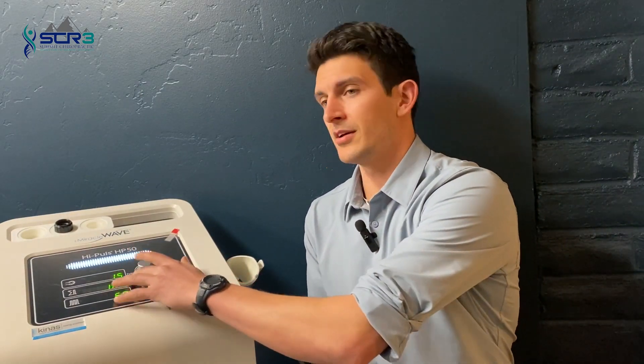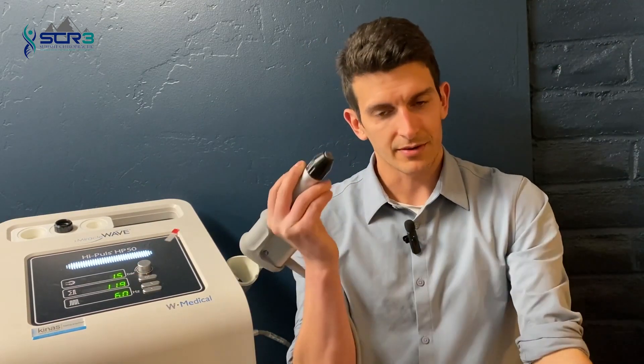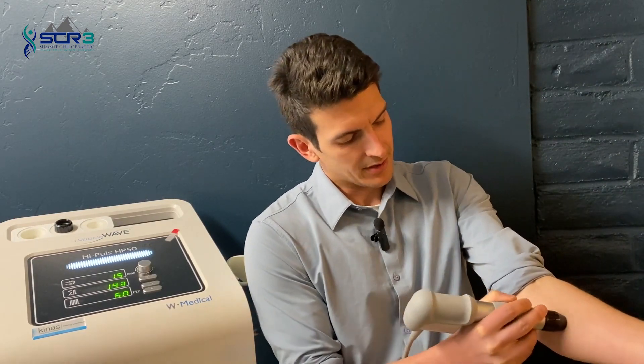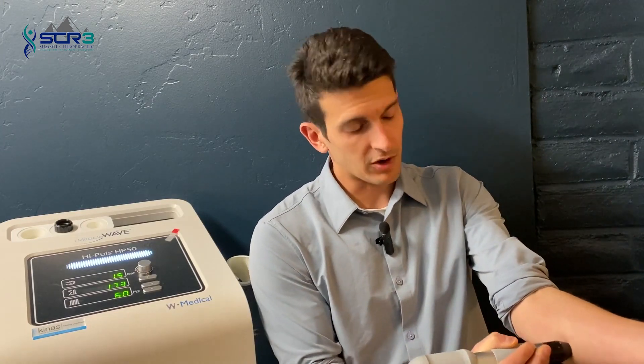With shockwave treatment, there's no anesthesia involved, we don't knock you out, there's no incision, and there's no surgery. It's an extremely safe type of treatment — which is why I can use this to treat my elbow right now, right here in front of the camera. We turn on the machine, you'll hear that kind of sound, and then you simply apply the transducer to the area.